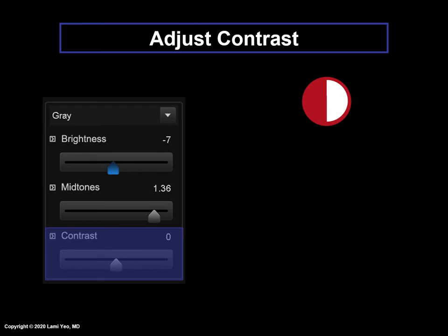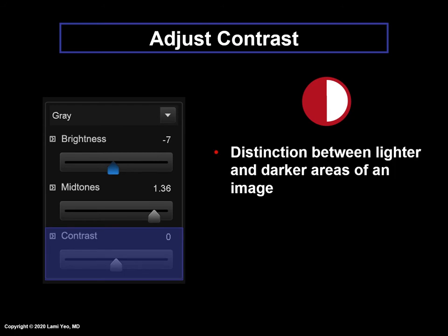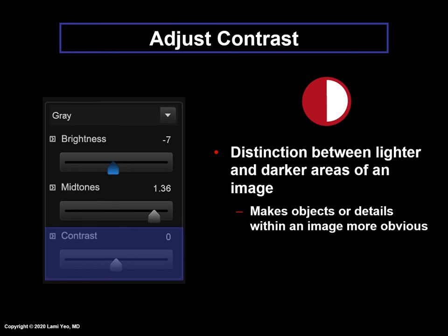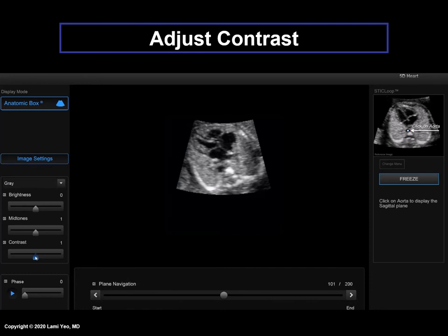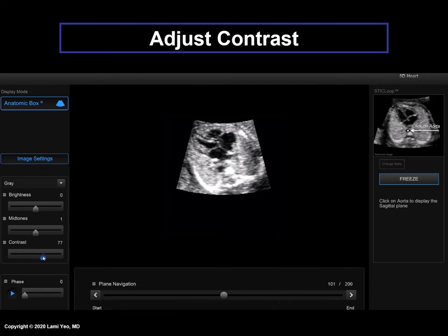Contrast is the distinction between lighter and darker areas of an image and makes objects or details more obvious. For the fetal heart, this will affect the fetal bones such as the spine and ribs. In this example, the contrast is increased and the light areas or white color of the bones become even more white. Obviously this is extreme, so one should find a contrast that doesn't lead to this type of image.